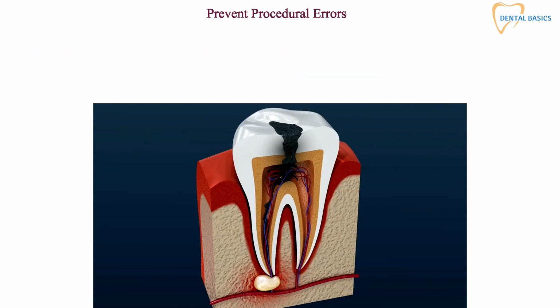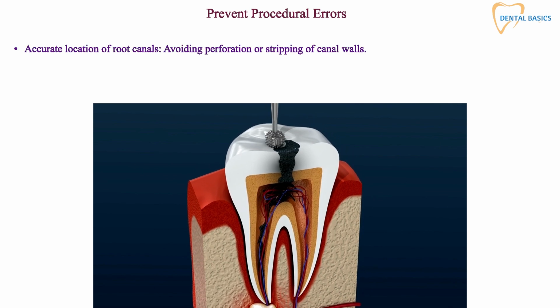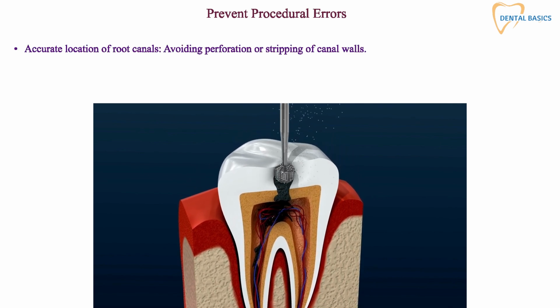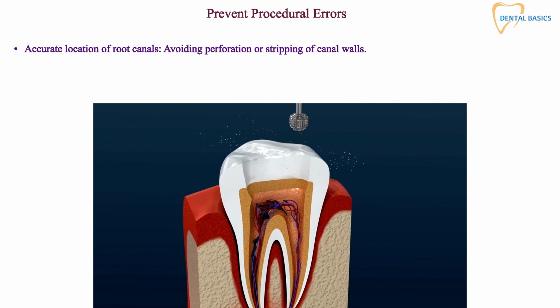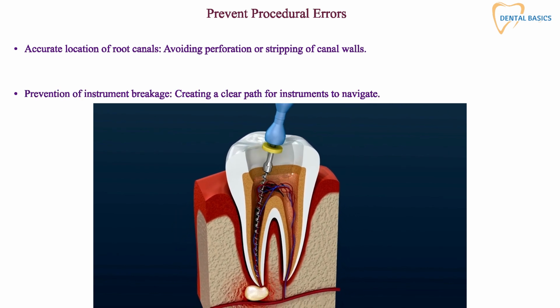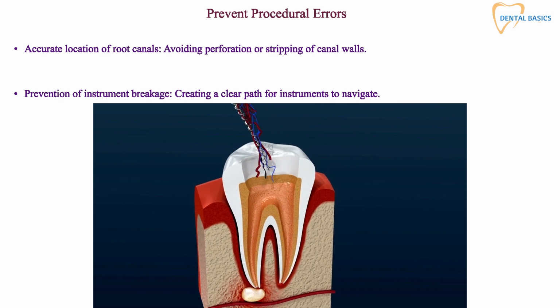Proper access cavity preparation helps minimize procedural errors that can lead to treatment failures. Accurate location of root canals, avoiding perforation or stripping of canal walls. Prevention of instrument breakage, creating a clear path for instruments to navigate.